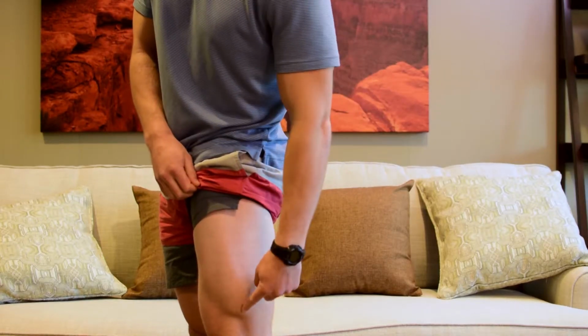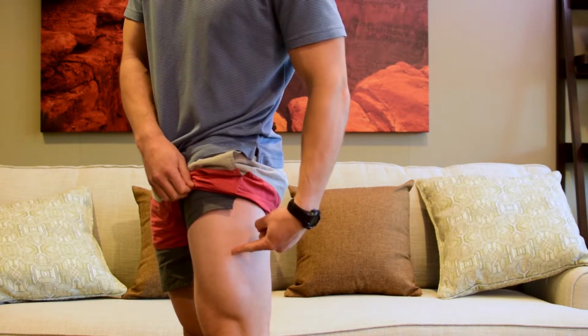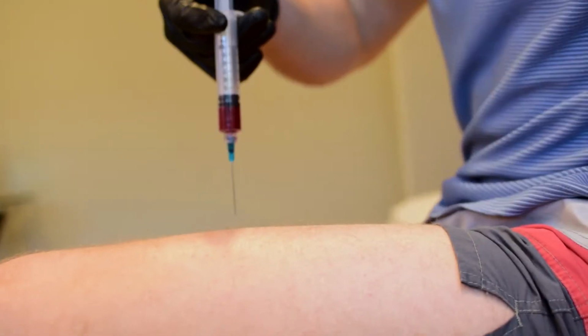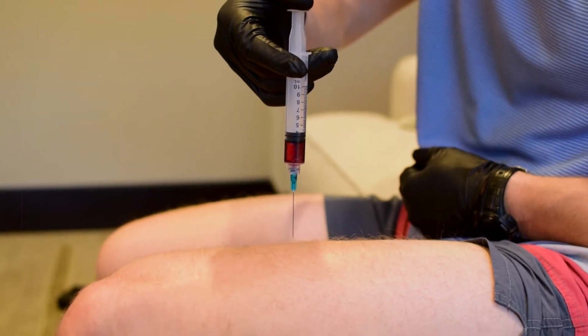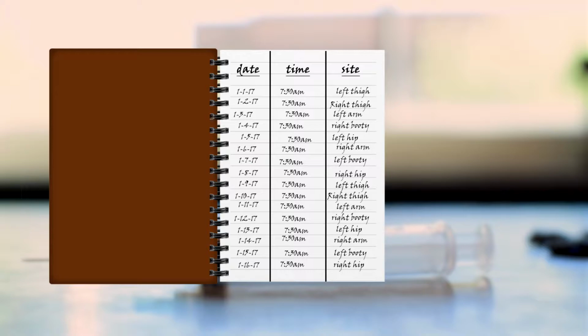The best site to perform an IM injection when you are alone is the thigh, since it's the easiest to access and see. It also has the capacity to handle larger needle sizes. However, it's always a good idea to switch up the injection sites to prevent any skin irritation and scarring. Keep a log of where on the body you last administered an injection, with date and time.